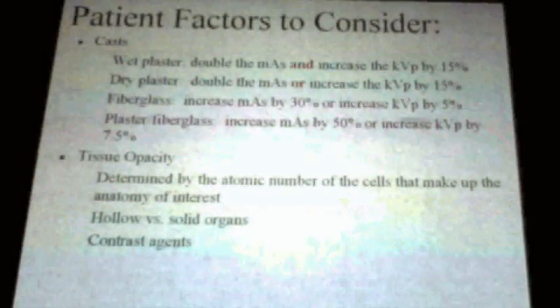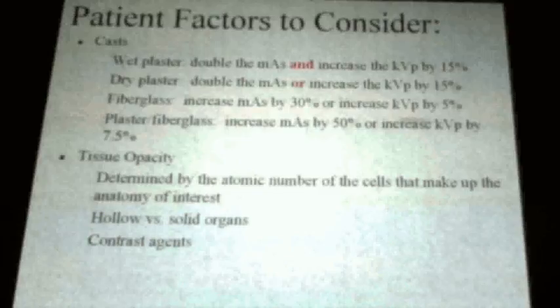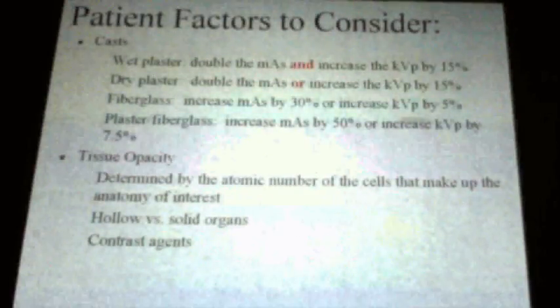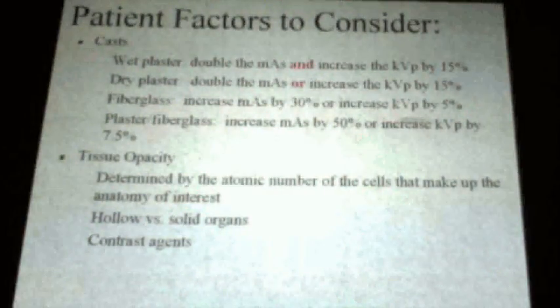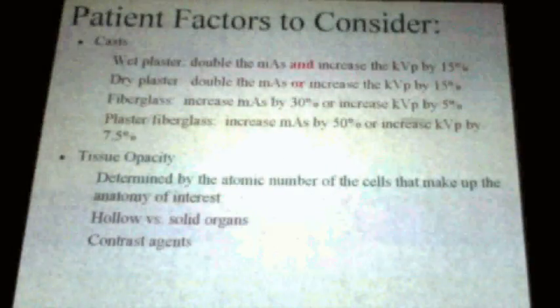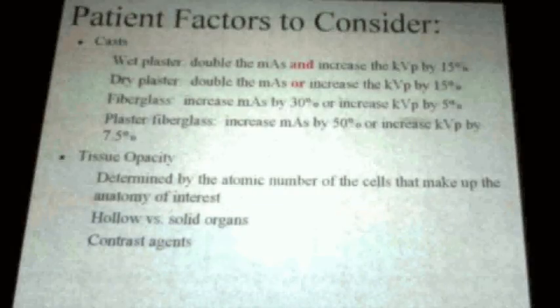So if they ever think that they've got a perforated viscus, which is just a perforated lining of the bowel, then they'll use Gastrografin. Okay. A little bit of an advanced question. With an iodine allergy, they normally change to the barium. But what would they do if they had a perf bowel and an iodine allergy?